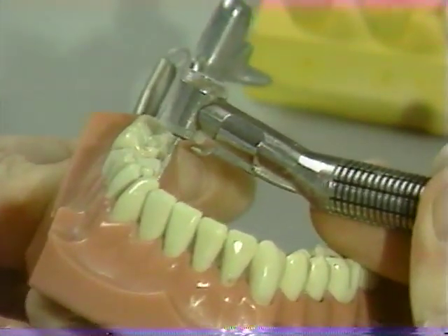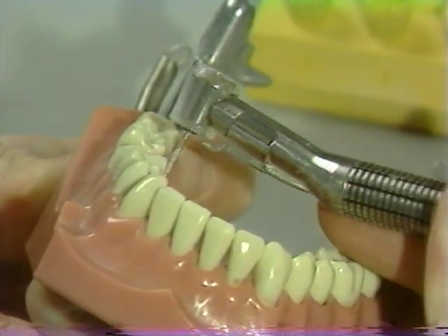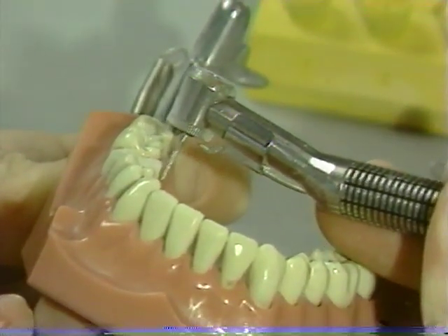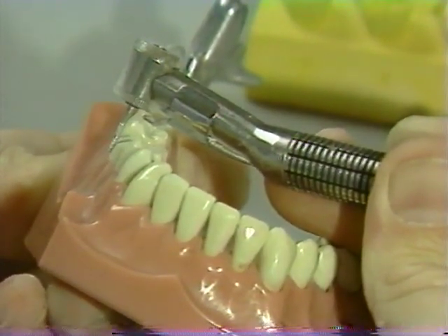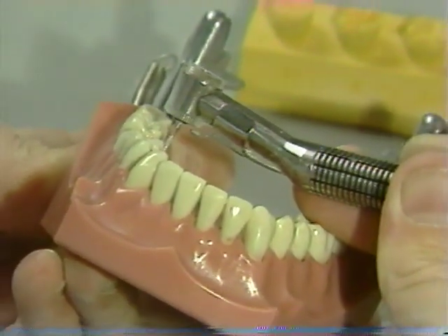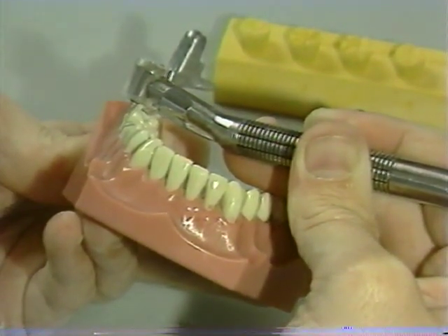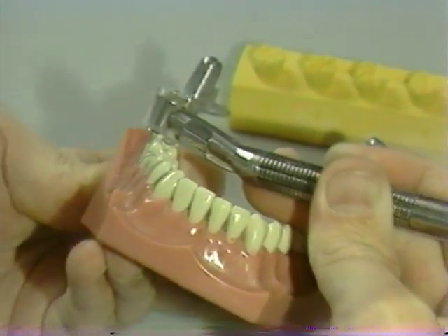From the lingual surface, the easiest manner in which this is accomplished is by placing the carbide, or placing the diamond in the lingual depth cut, raising it and moving it parallel to itself and holding it against the buccal surface. You may have to practice this movement several times. Once satisfied that a parallel orientation has been obtained, proceed and place the buccal depth cut.